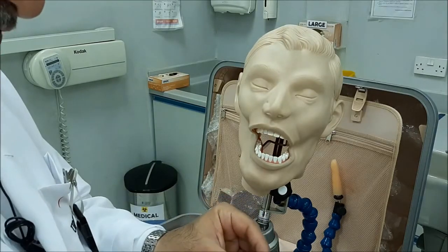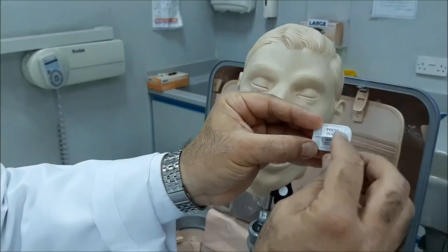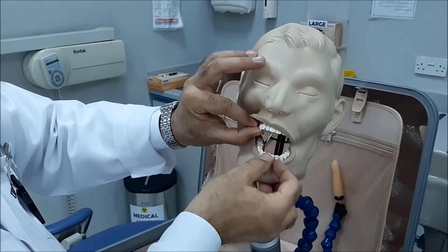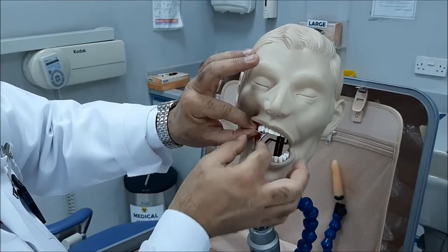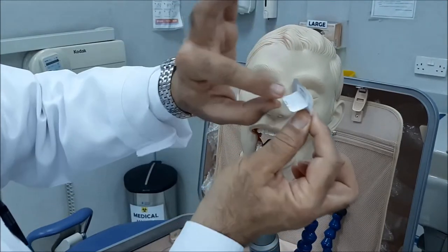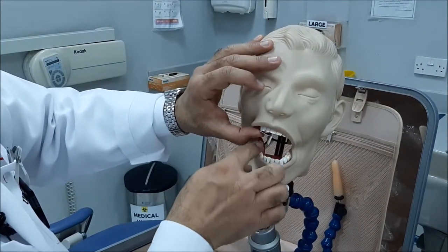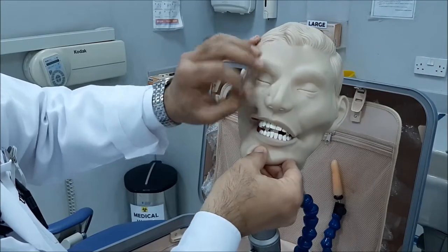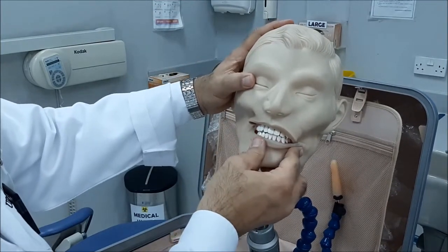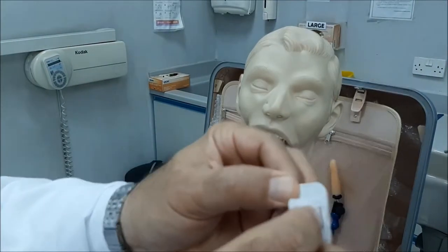So what I need to do to get it right: first, put it in the middle; second, put it on the two premolars and place the tab, but don't bring it too much to the buccal side. Try to push the film all the way down as much as the tab allows, toward the midline, so that you free the space and allow the patient to bite, and avoid detachment — because it can come out easily.